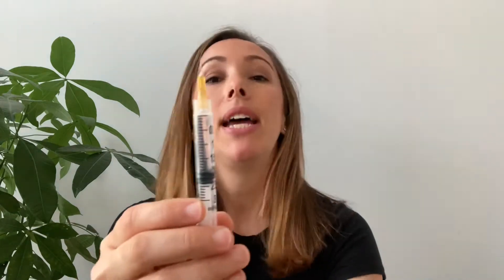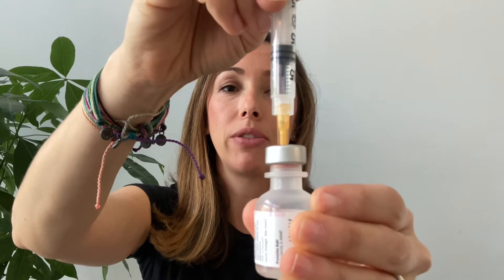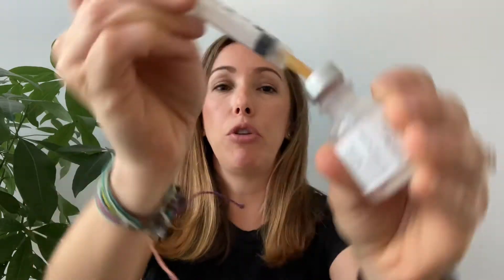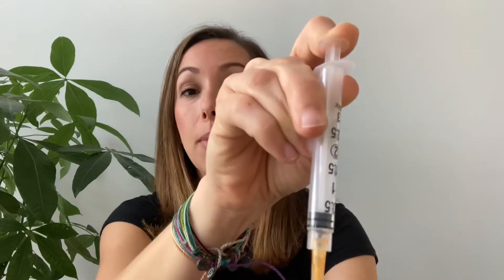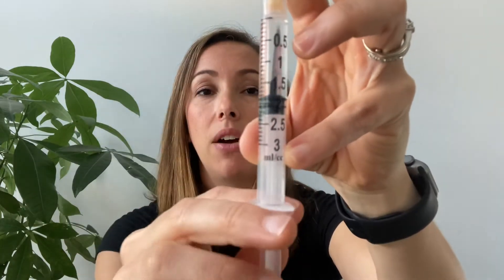Grab your vial of insulin and stick your syringe straight into the port and push all the air into your vial. I prefer the vial to be upright — if you push air in when the vial is upside down you may create more air bubbles. Now hold the plunger and turn everything upside down. This creates pressure so when you let go of the plunger the syringe starts to fill on its own, helping you get fewer air bubbles. If you have any bubbles at the very top you can push the plunger up slightly to release them. Bubbles on the sides — just leave them for now.